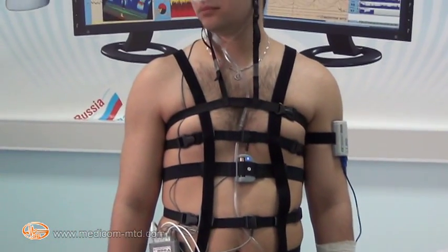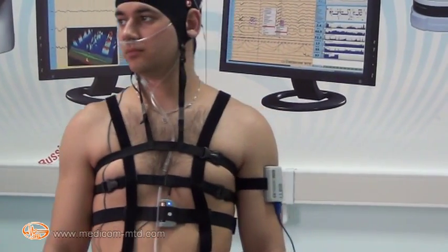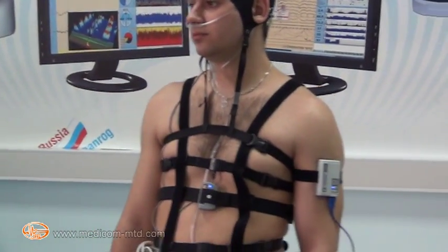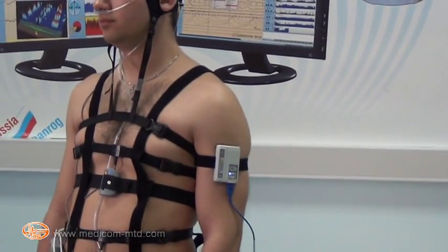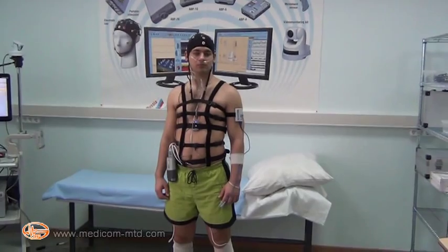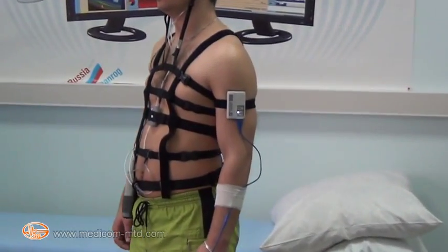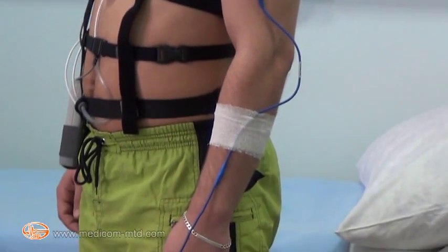On the upper arm of the patient there is a wireless pulse oximeter module with a sensor on the finger. Signals from wireless sensors are transmitted via Bluetooth channel, received by the ABP unit, and integrated into the general data stream to a personal computer.